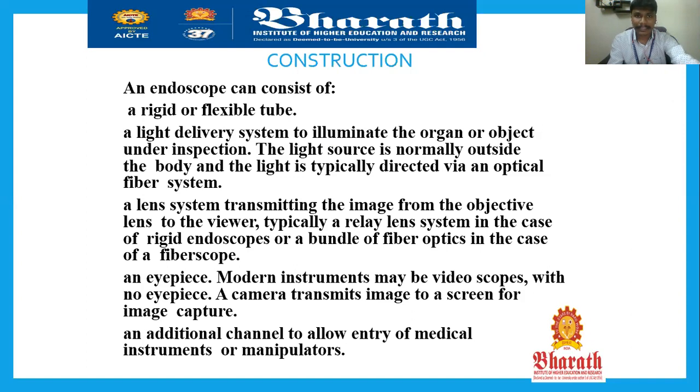and that will be considered as an eyepiece, which is watching and capturing the data inside the internal organ. So it is known as an eyepiece. A modern instrument may be a videoscope with no eyepiece. A camera transmits the image to the screen. This is the advancement. Initial endoscopy used fiber optics.